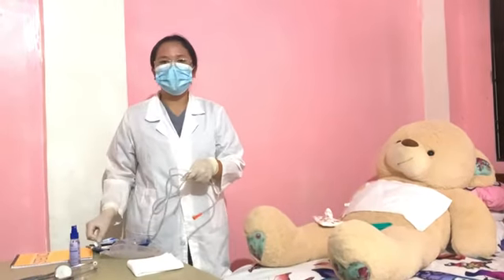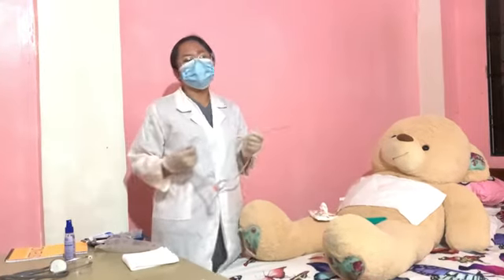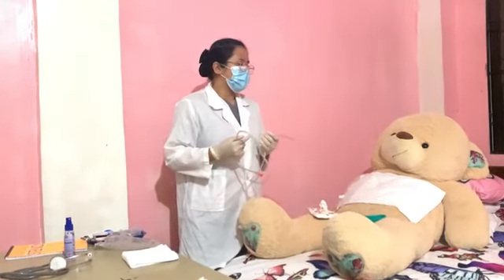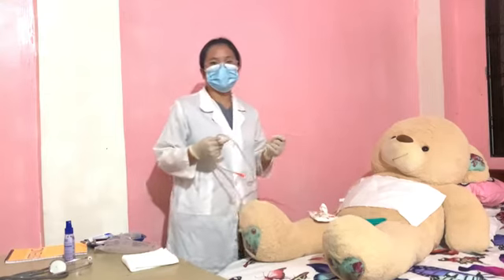I've already lubricated it. And then apply topical anesthesia to the nostrils and oropharynx as appropriate. After selecting the appropriate nostril, which I already did, ask the patient to slightly flex the head back against the pillow. Ma'am, can we flex your head back against the pillow po? Thank you. This is for easy insertion of the NG tube.